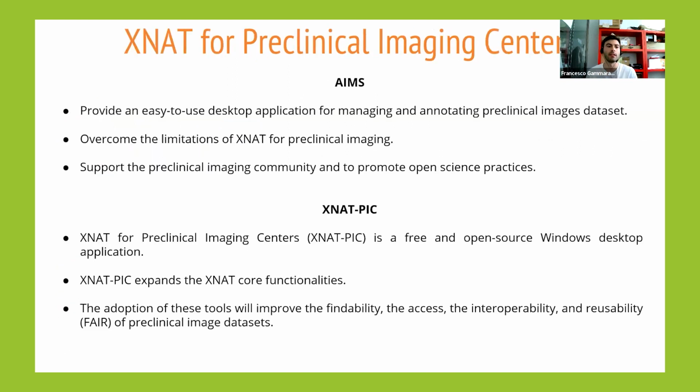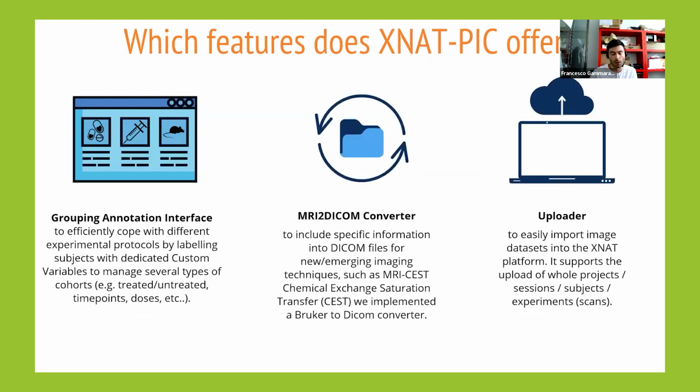So our aim is to provide an easy-to-use desktop application for managing and annotating preclinical image datasets. And we want to overcome the limitations of XNAT for preclinical imaging. So we have developed XNAT-PIC, that stands for XNAT for Preclinical Imaging Centers. That is a free and open source Windows desktop application. The features that XNAT-PIC offers are a grouping annotation interface, that is a dedicated interface to edit the custom variables for your project.